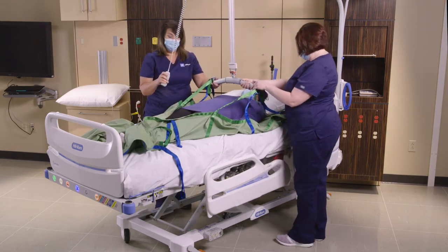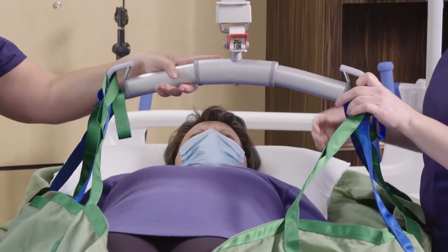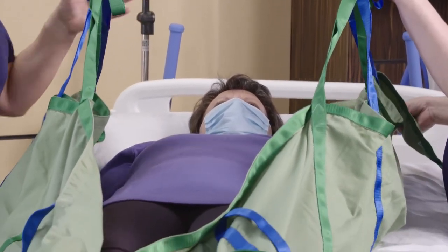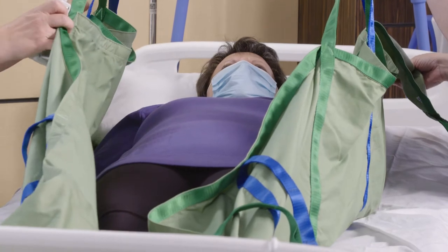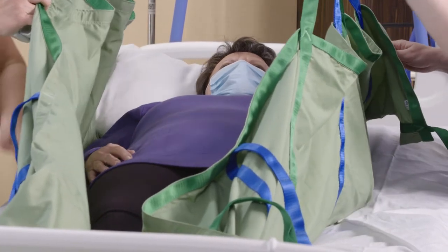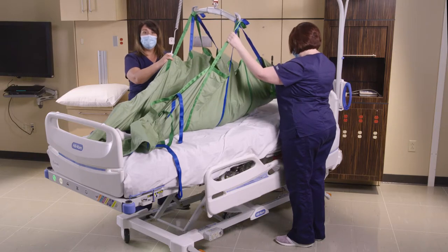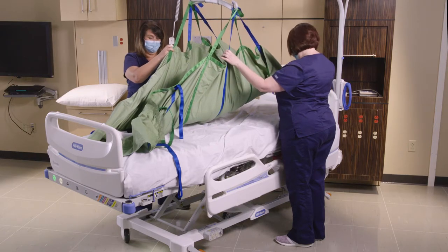We're going to raise the patient up so we can get a boost to put her back towards the head of the bed. Once we get her up to a certain point, we just want to clear the surface. I don't want to lift the patient as high as the lift will allow — I only want to clear that surface.